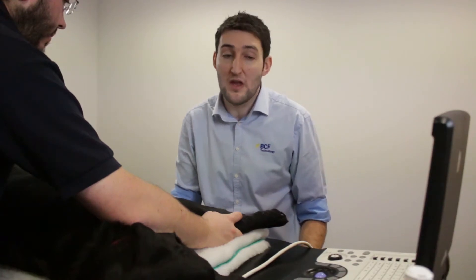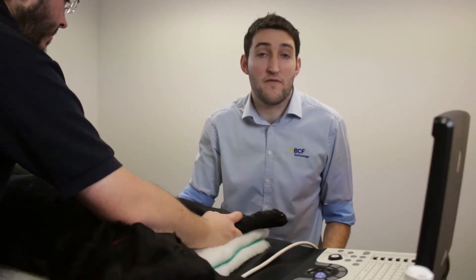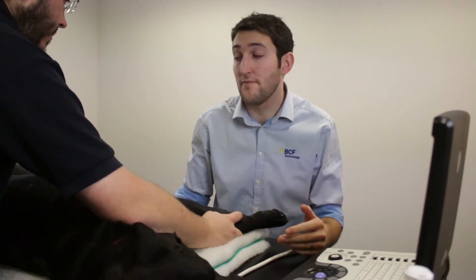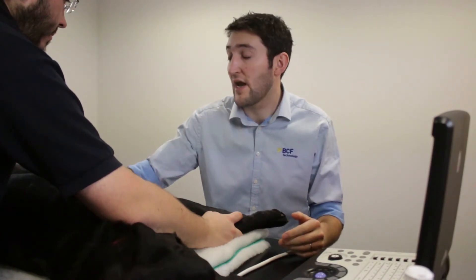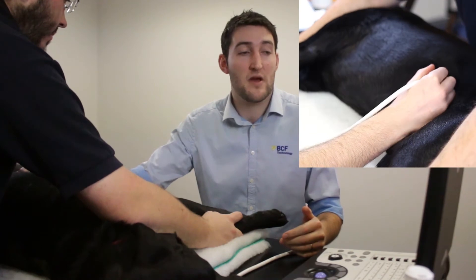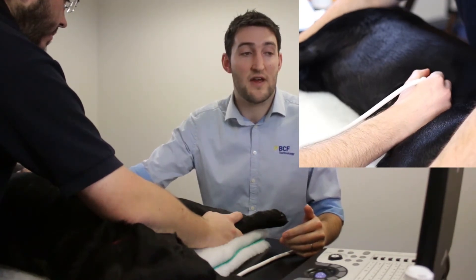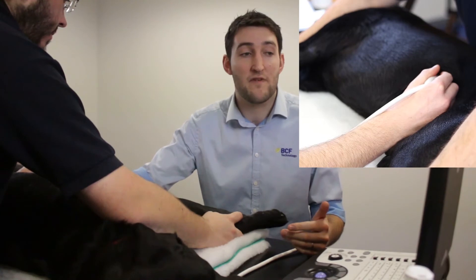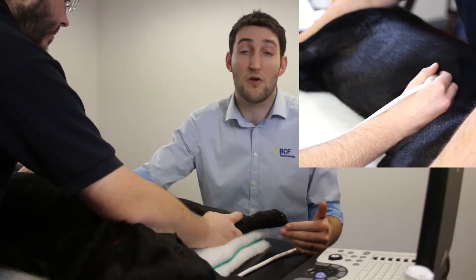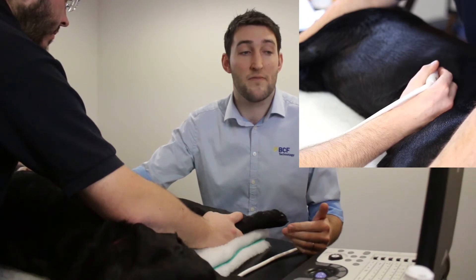From the diaphragmatico-hepatic view, we're then going to move up to the left flank or the splenorenal view. With the probe in place, all we're going to do is fan up and fan down. What we're looking for is fluid around the kidney, between the kidney and colon, and between the kidney and spleen, and spleen and colon.